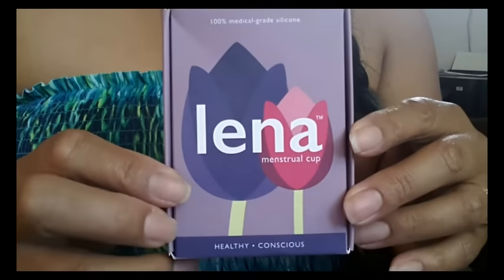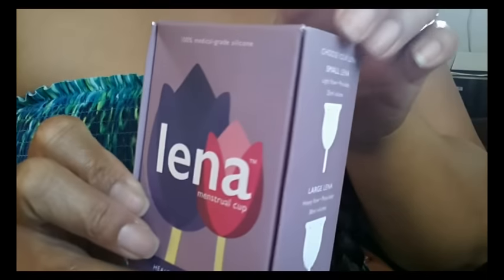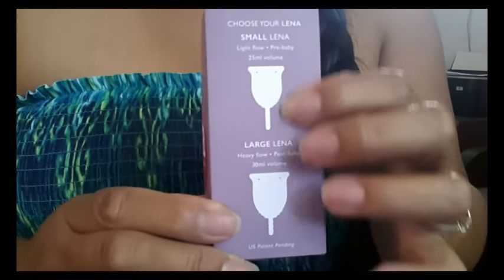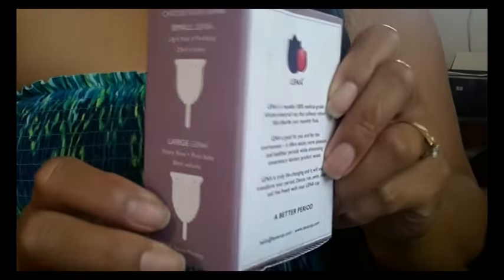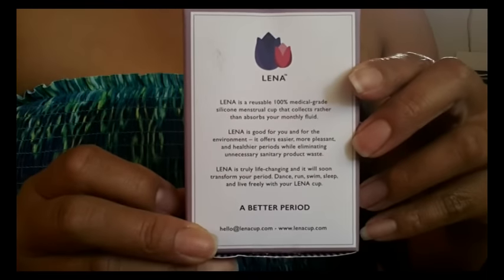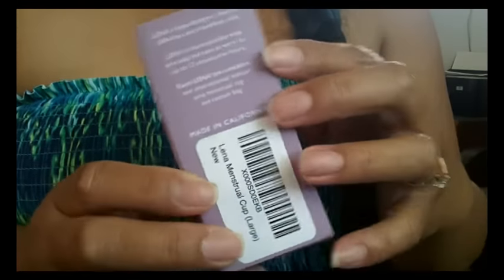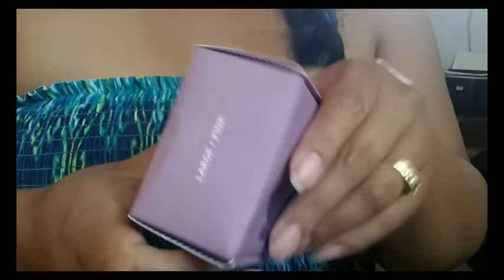Here is the Lena box — this is the front and I'll just do a quick turnaround. The cup comes in two different sizes and it only comes in this pink for now. This is a size large and again it's in pink.